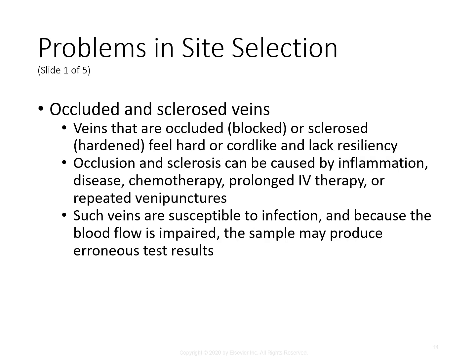If you have problems at the collection site, there are times where you go to the vein and there's an issue. The antecubital fossa is the most common site for routine venipuncture. However, the presence of certain conditions at that site may alter the quality of a specimen or cause harm to that patient. So if you run into any of these issues, then you need to choose another site for the blood draw.